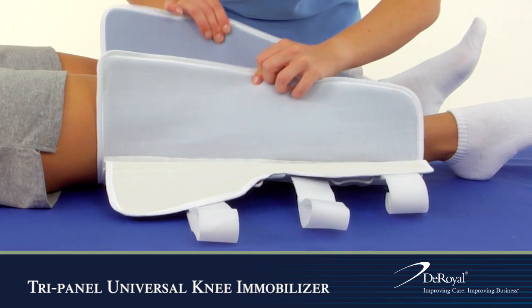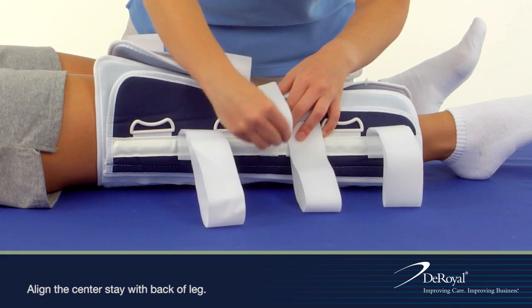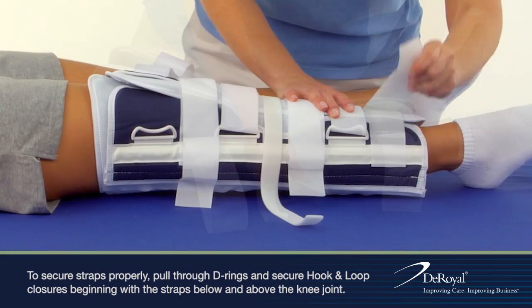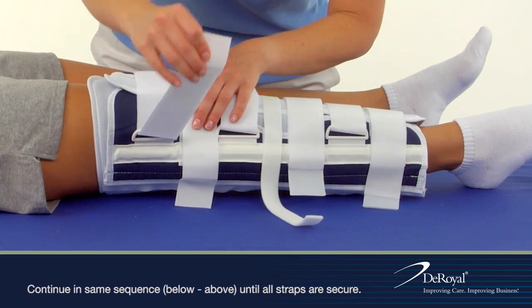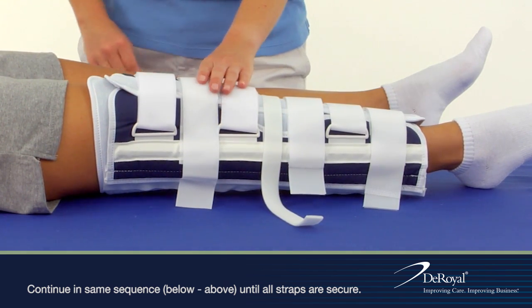To apply, wrap the immobilizer around the patient's leg. Use the attached helper strap to hold the immobilizer in place while you secure all straps, beginning with the straps below and above the knee joint. Continue in the same sequence, below and above, until all straps are secure.